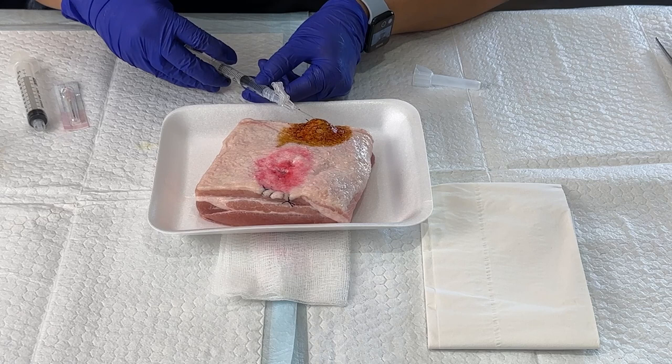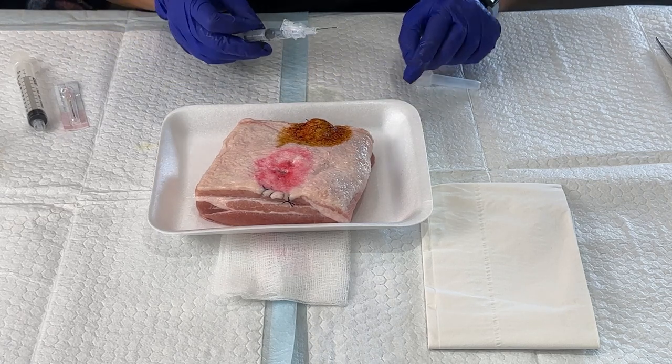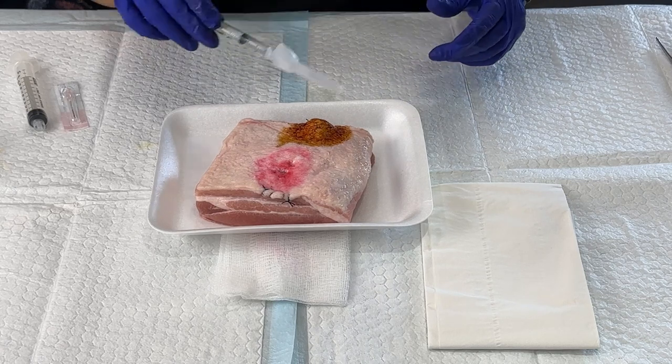Withdraw it and inject, and you'll see a little wheal form of anesthesia right where you're going to be injecting the 18 gauge needle. So you want to numb that up really well.